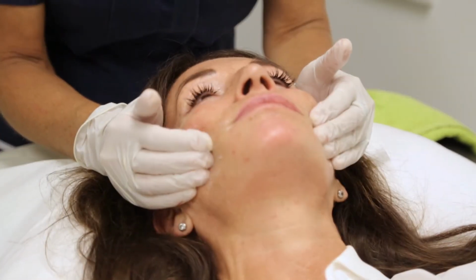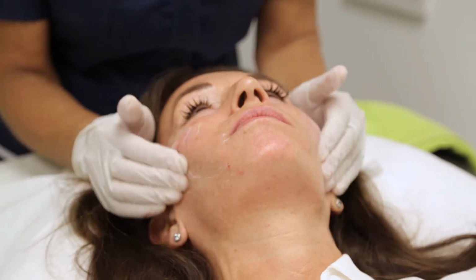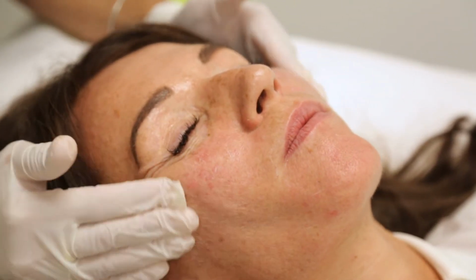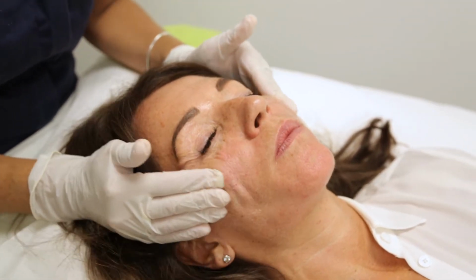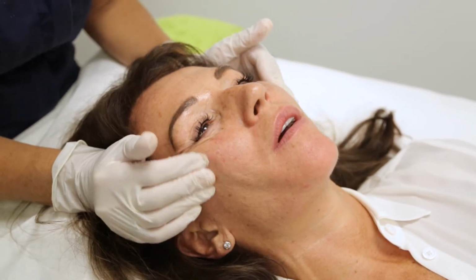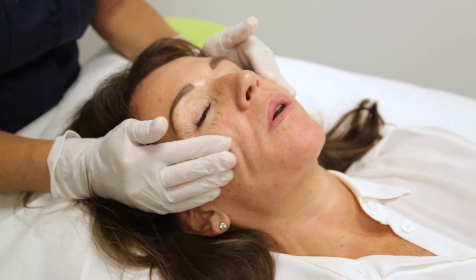Obviously, the way that I'm massaging this area is quite deep tissue massage, yeah? So the areas that I've covered, what I want you to do is do similar movements, okay? Where it's not just a case of just smoothing these areas out. What I'm actually doing is making sure I'm happy with it, but I want you to stimulate the growth where I've put it by massaging for a few minutes twice a day.